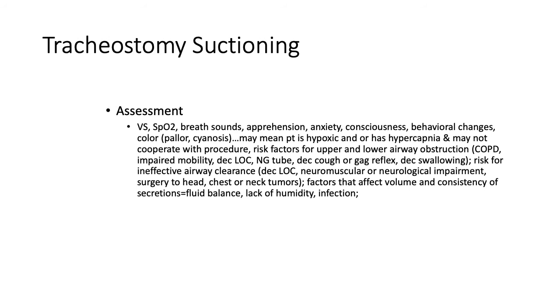Now on to assessment before tracheostomy suctioning. As nurses, we begin assessment from the period that we walk into the patient's room. So when you walk in, you're looking at your patient's color. Is the color of the patient what's expected based on ethnicity, or are they pale? Does that indicate potential hypoxia? What is the patient's behavior? Are they alert and oriented?